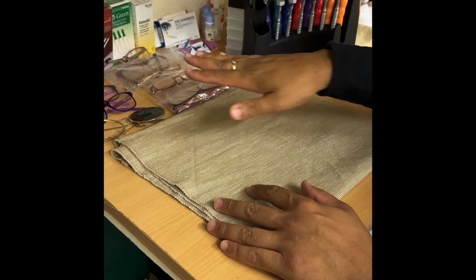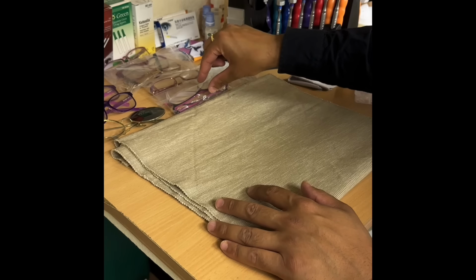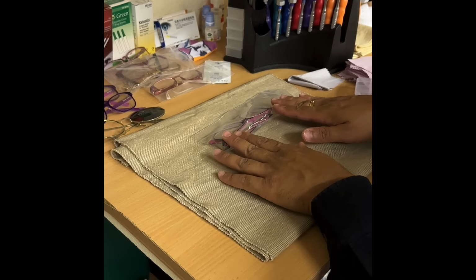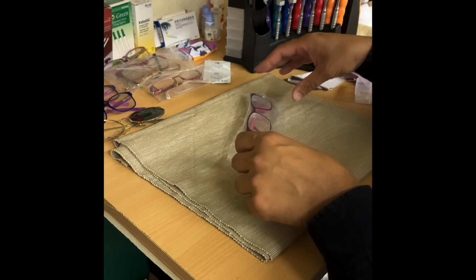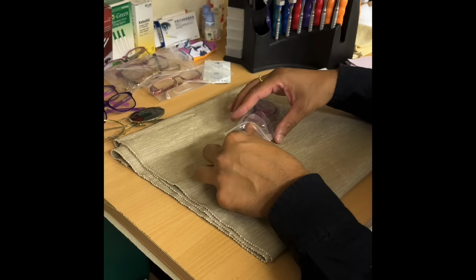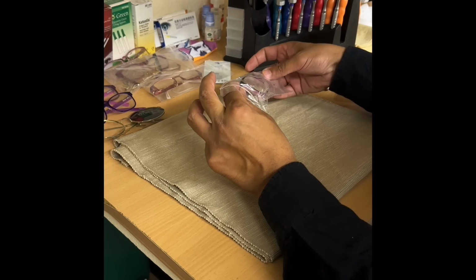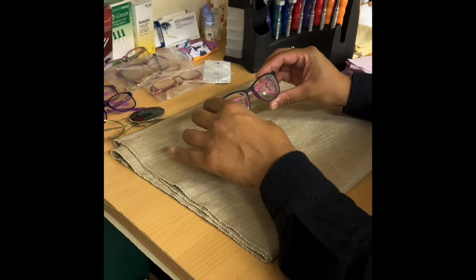Thank you for bringing all your family's spectacles into the practice. Going to give them all the once over and see what needs doing. So the first pair, plastic frame. Let's see what the damage is.